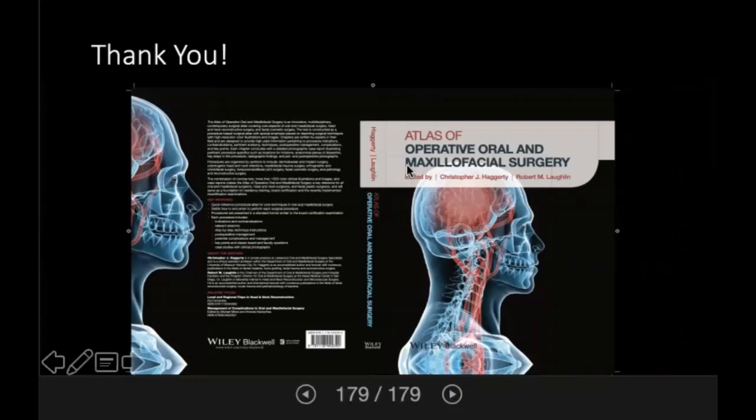Okay, so there's another question that you've answered previously in the chat or the Q&A box. This question said, should we reline the dentures at the same session or are we scanning the patients and the denture? Or is it a step done prior to the session? So the answer is to reline either a few weeks ahead of the workup or at the appointment. The most important thing is to fill the gaps and just make sure that there are no voids and spaces between the underlying tissue and the denture. So that answer was done in the box.